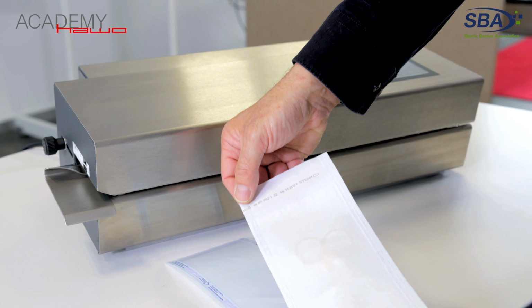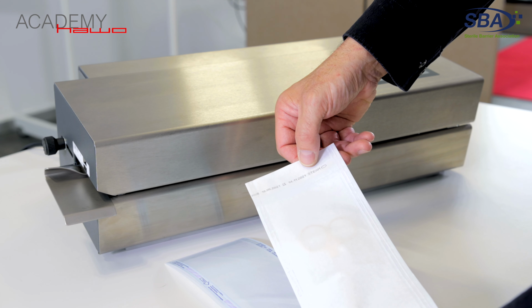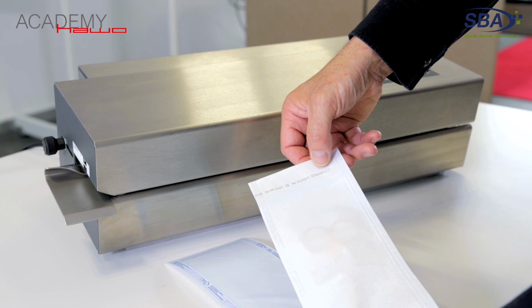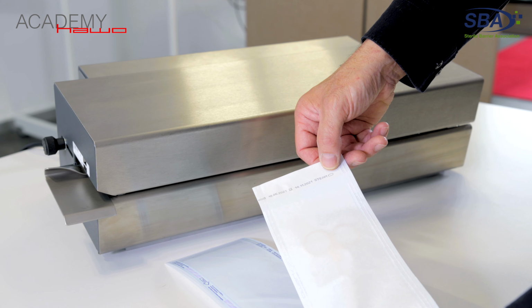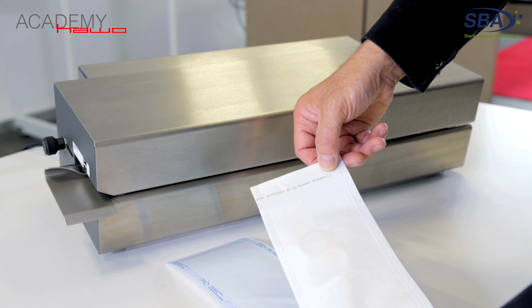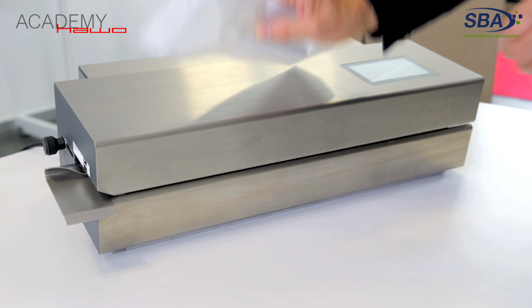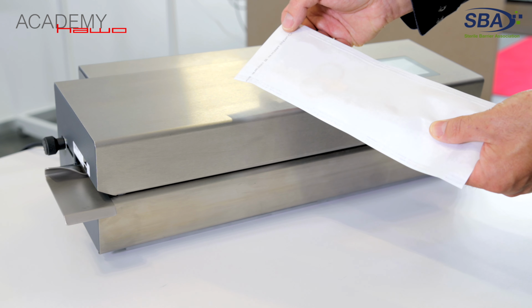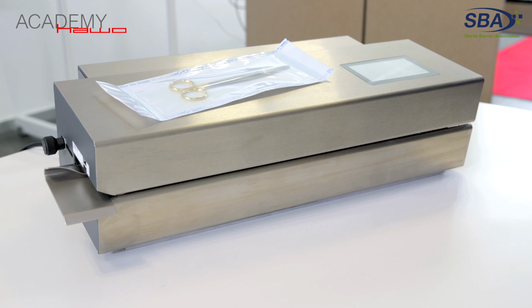And as an example, we chose for you a packaging date, use by date, as well as the sterilization method, steam, including the solid line for a sterile barrier system validated microbial barrier. In the following, we will also be showing to you some examples of the more complex symbol printouts with the solid line as well as the dashed line.